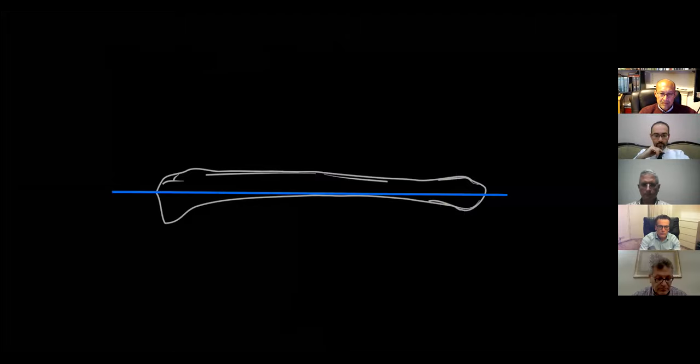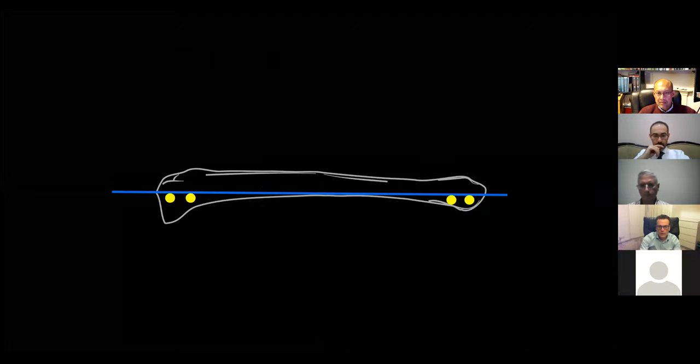Now, drawing the anatomical axis, we can draw this on the lateral view. And it doesn't matter whether you place your pins on the sagittal plane, or in the middle or behind, or whether you place them against the coronal plane. As long as they're perpendicular to the axis, you can achieve the result to correct your deformity.